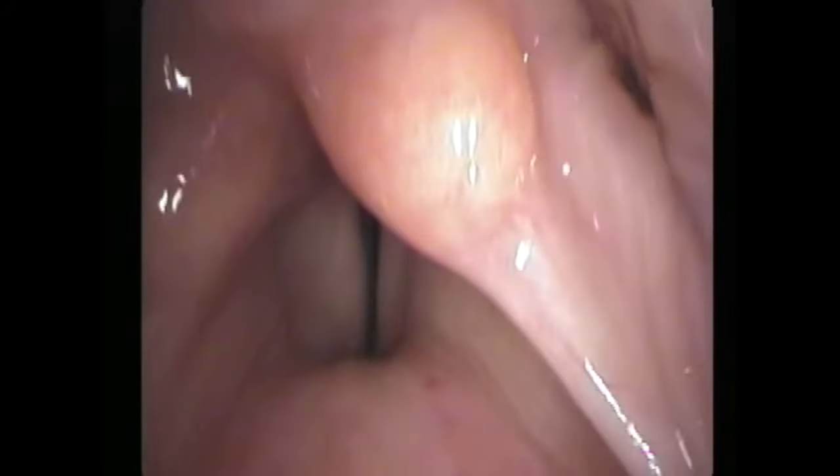So here we have a weak, breathy voice, but the glottis closes very quickly. The false vocal cords cover the true vocal cords, and the arytenoids cover the vocal processes. So we hear a problem leaking air, but we can't see what's going on with the posterior commissure. So we'll apply topical lidocaine and have another look.